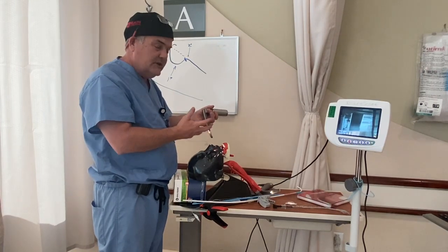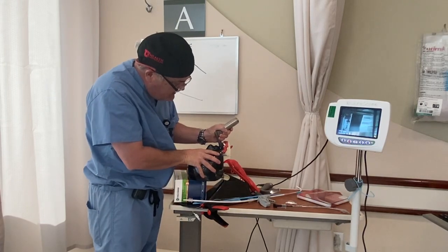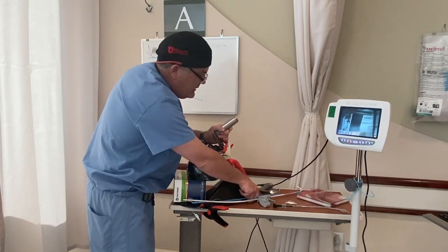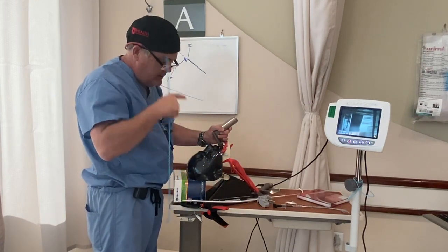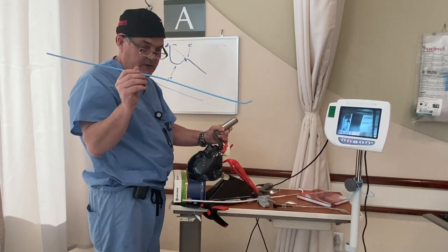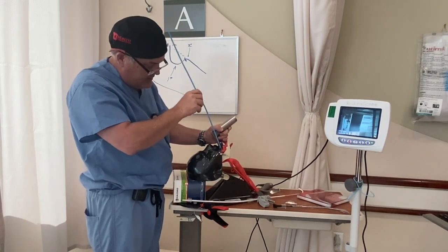The blade goes in, and I use it to flatten that primary curve — you can see it lifts the jaw and flattens the inflection point. Now we have a linear tracheal axis. By definition, my line of sight to the vocal cords is straight, or I wouldn't be able to see them. Bougies are linear tools and work best used as such — this is when outcomes are most consistent — and I place the bougie into the trachea.